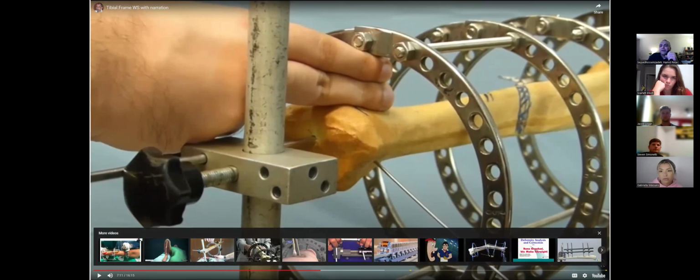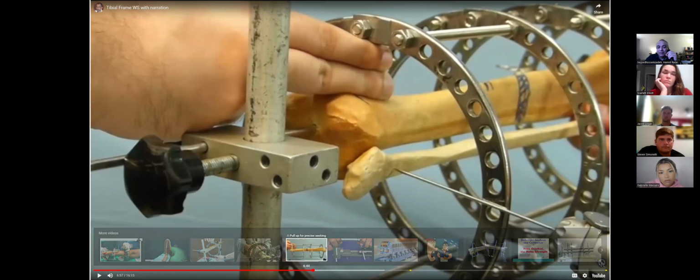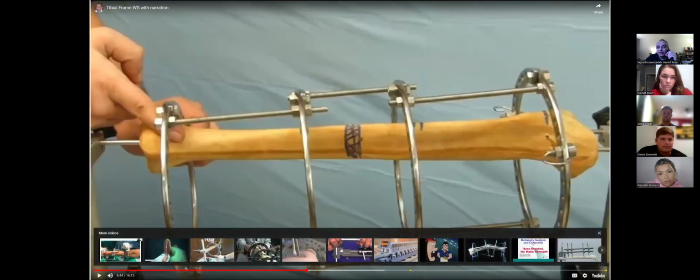The rest of the thing is repeating the putting of the wires, but as you saw here, the wire that was inserted was fixed on one side and then put under tension on the other side. And you see here, although this is a very heavy construction, it cannot bend. It remains in place because of the tension in the wires. That is how these things work.